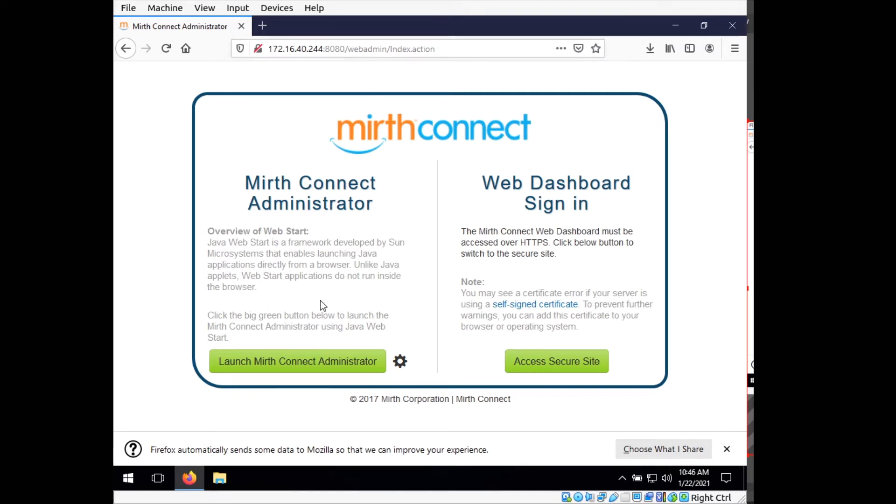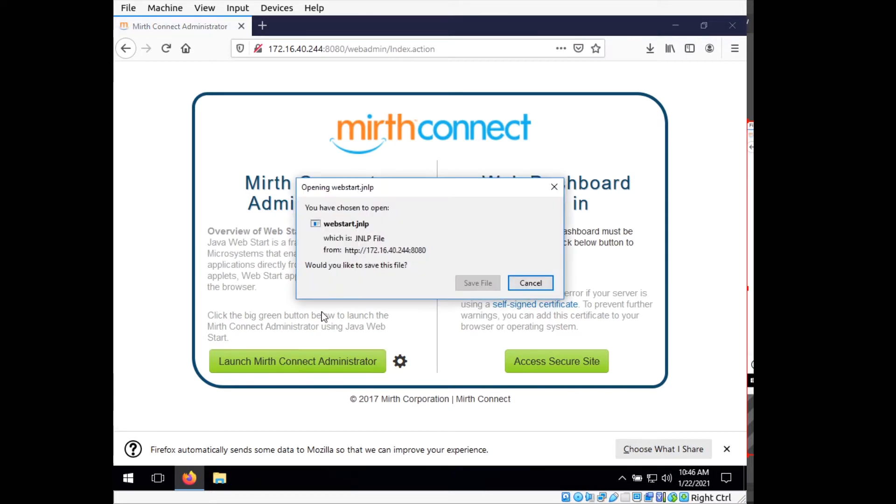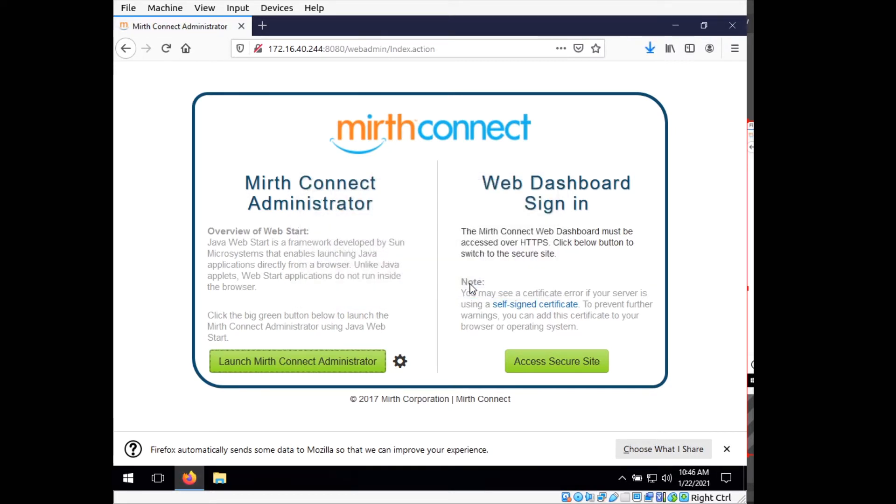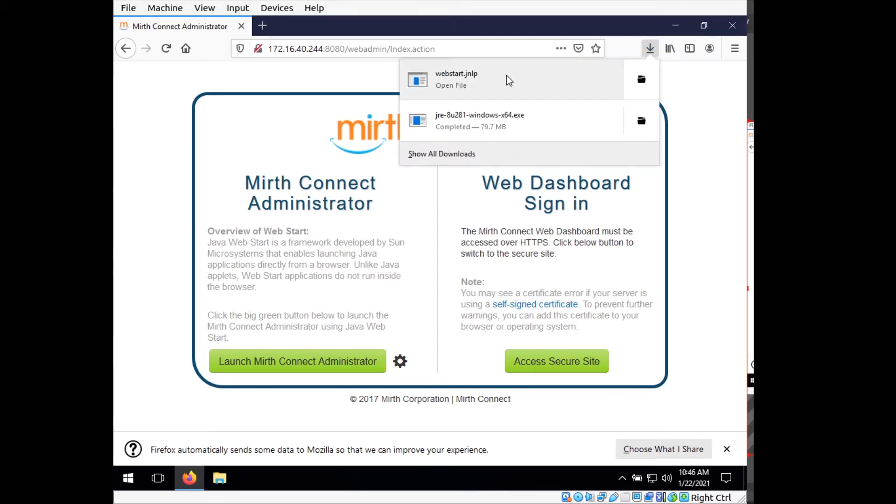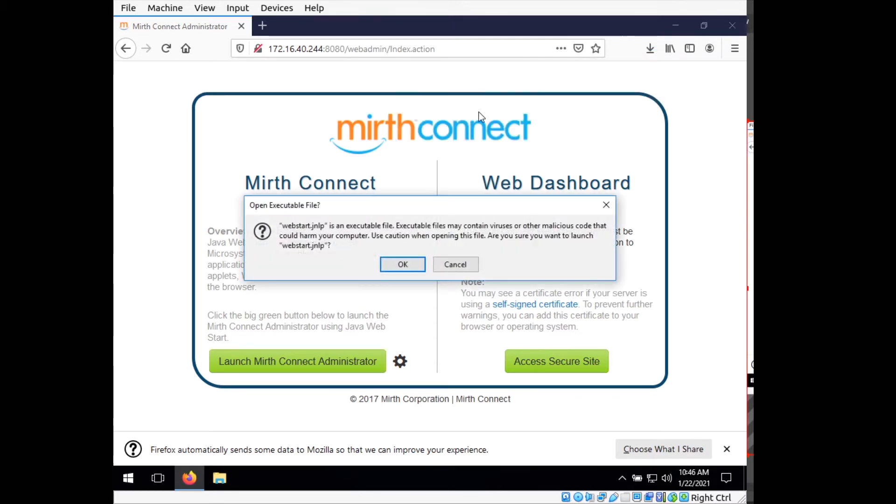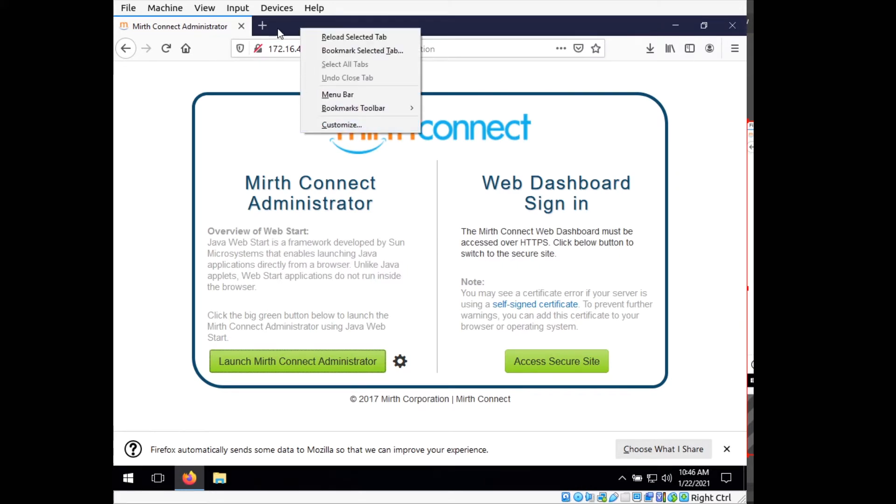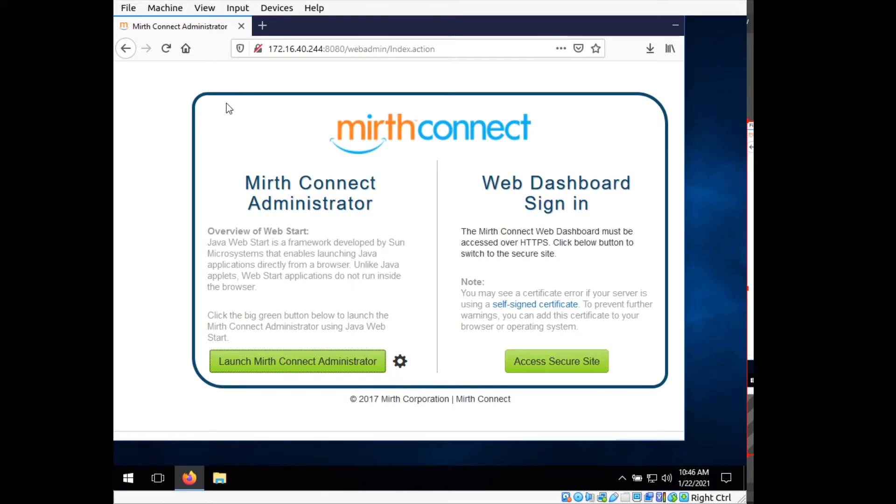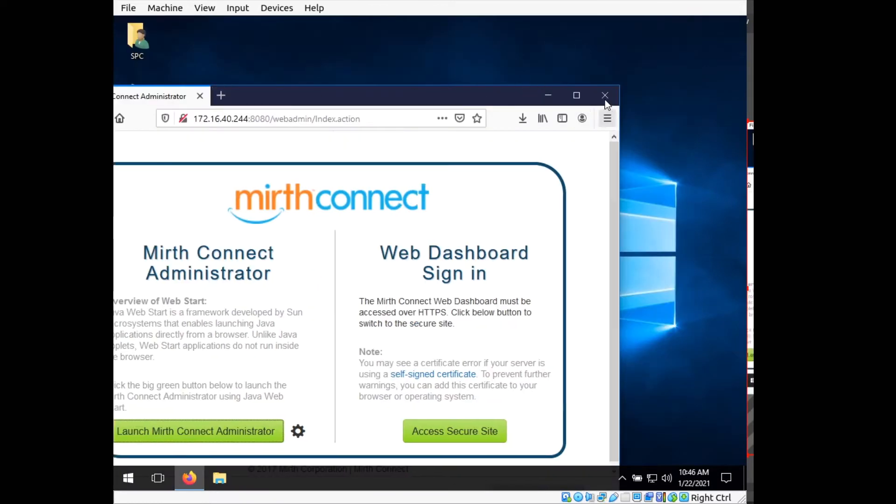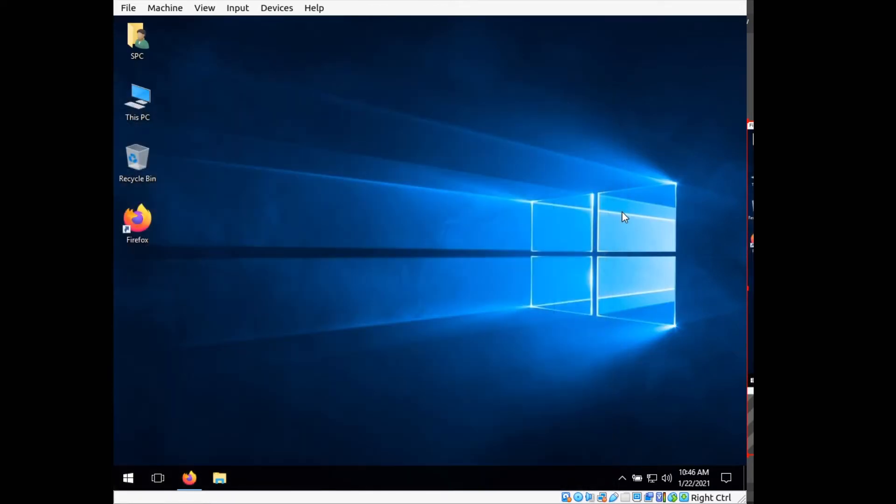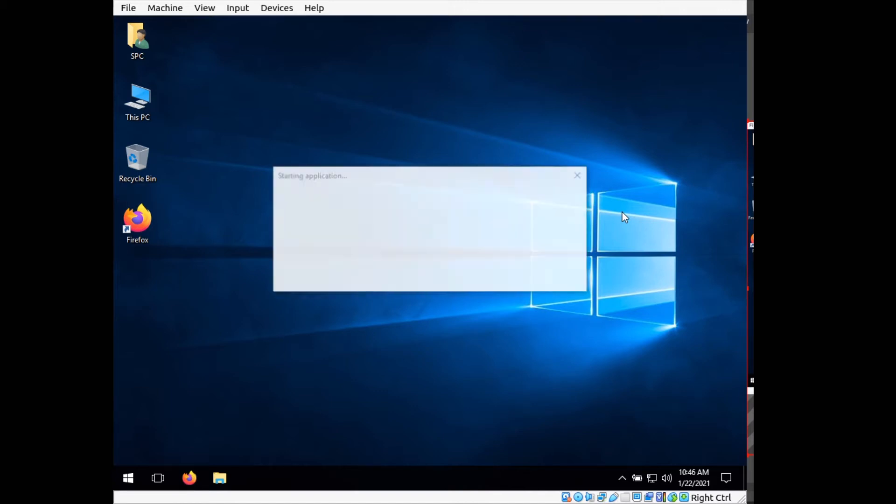So we want to go ahead and launch Mirth Connect administrator. This will download this web start file, go ahead and save it, and then go ahead and run it. We can close out of Firefox now, or your web browser, whichever happens to be.